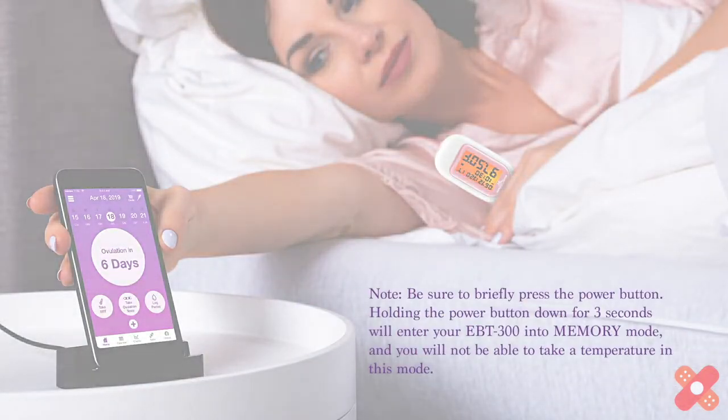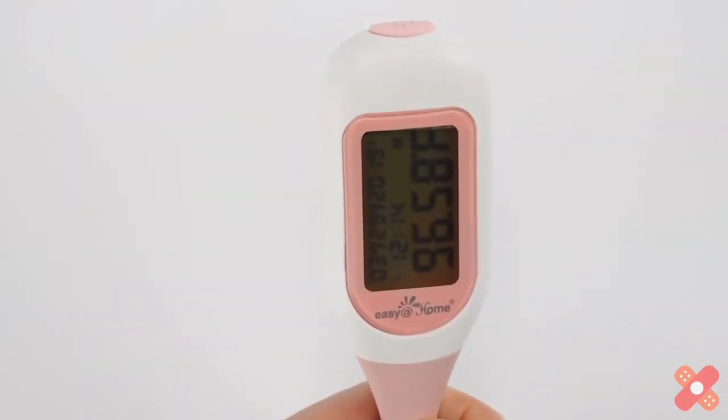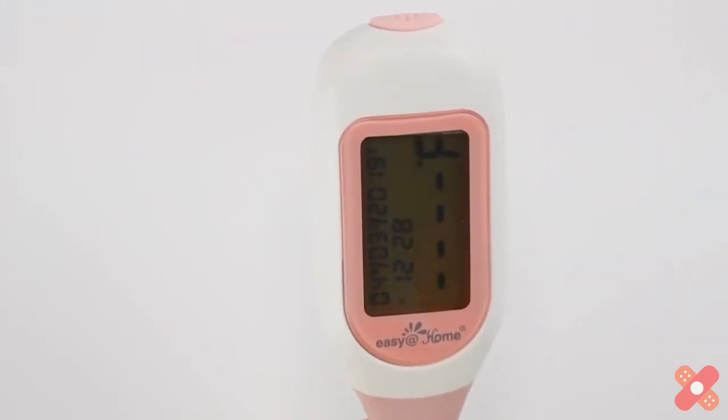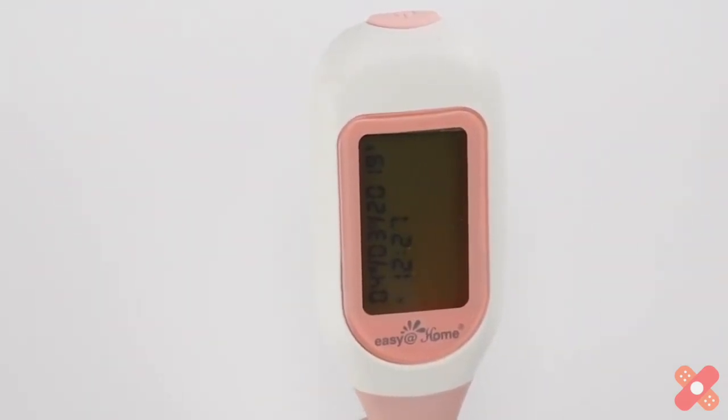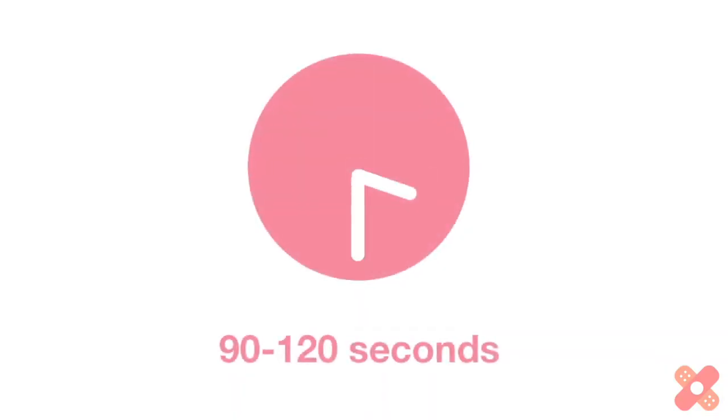Otherwise, simply turn on your thermometer. Upon waking, gently tap the power button for one second to turn the thermometer on. You will hear a single beep. Your BBT screen will light up when you first turn on the device, but will turn off again within 15 seconds to conserve your battery. Place the probe under your tongue and close your lips, and hold the thermometer in position.